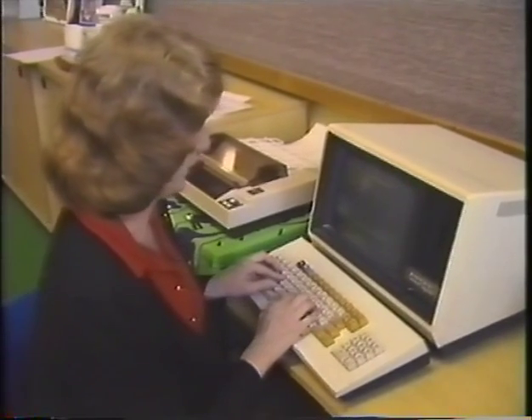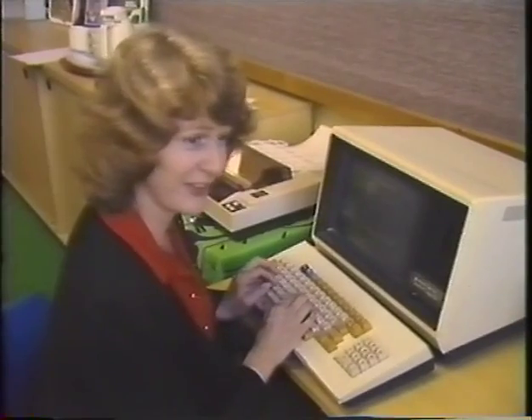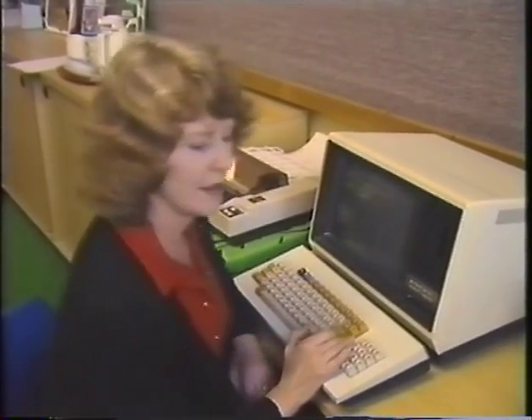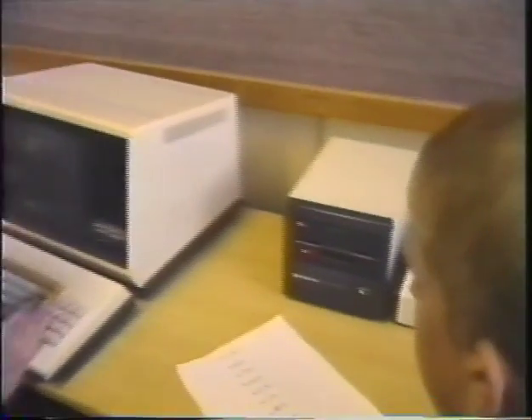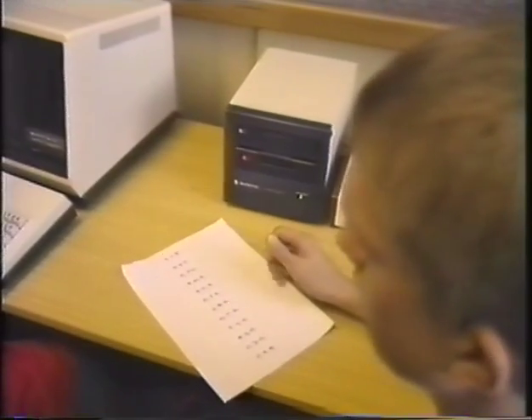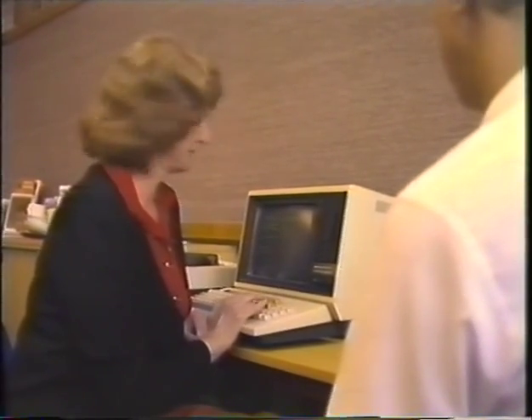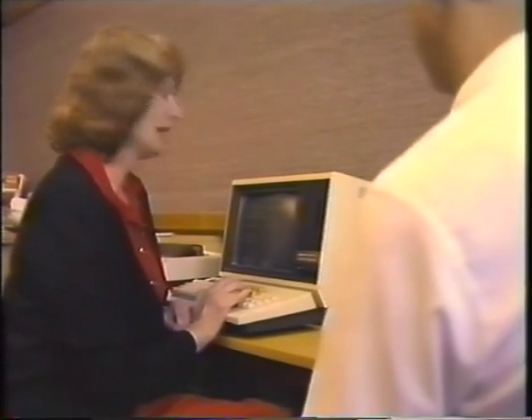The first one is lip reading with the speech processor. Is it turned on? Okay. Apa. Papa. All right. It was P. Apa. Okay. Ava. Papa. Ana. Mama. Good. Asa.